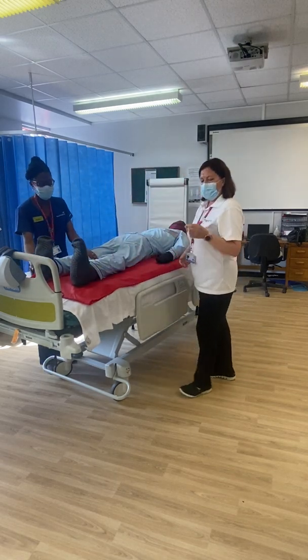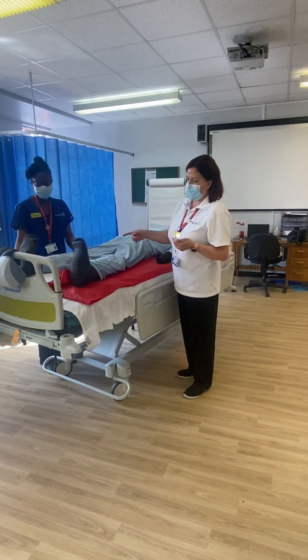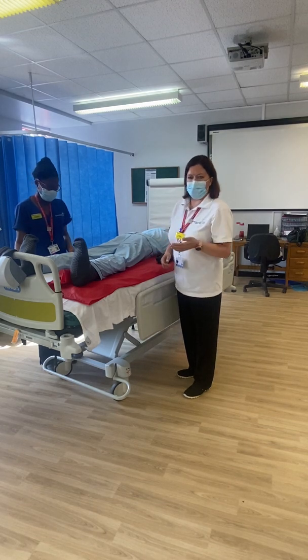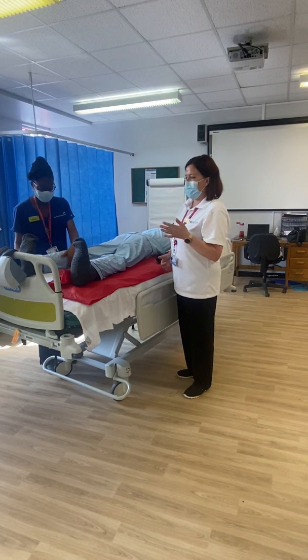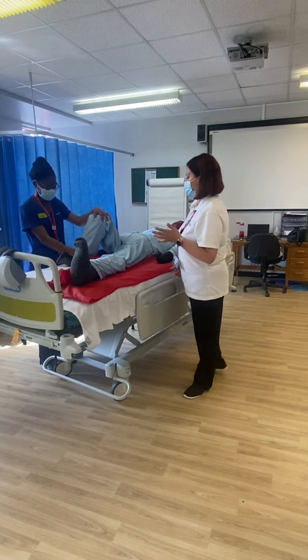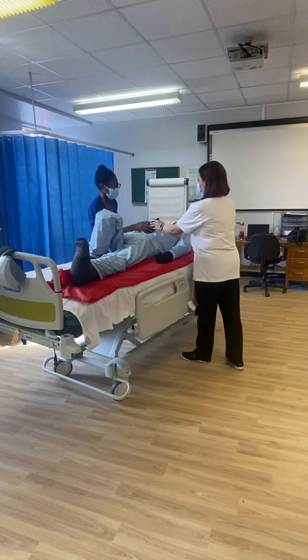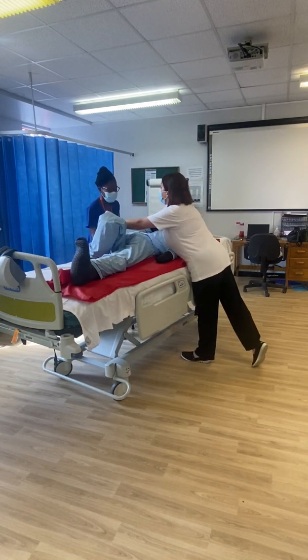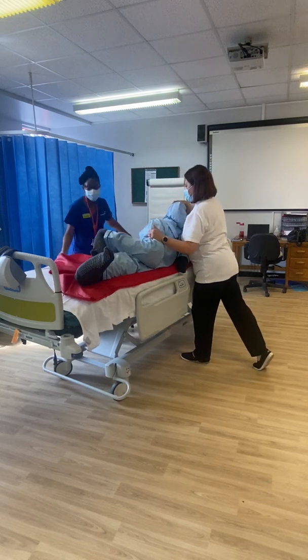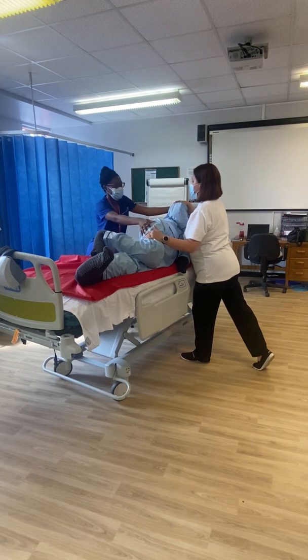And we're now going to roll the patient in the opposite direction. At this point, it's really important then when Priscilla bends this knee that the foot is not on the slide sheet, because if the patient tries to help and their foot is on the slide sheet, they risk slipping and injuring themselves. Ready, steady.